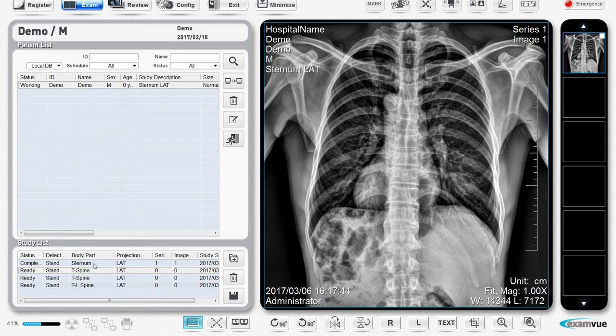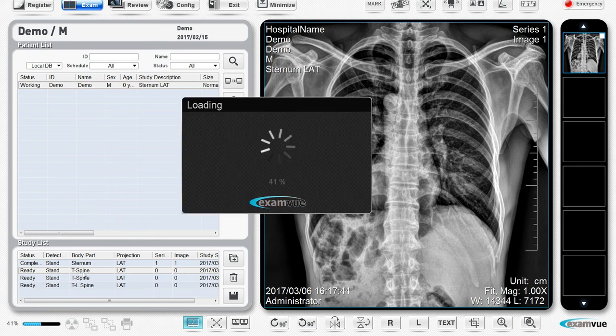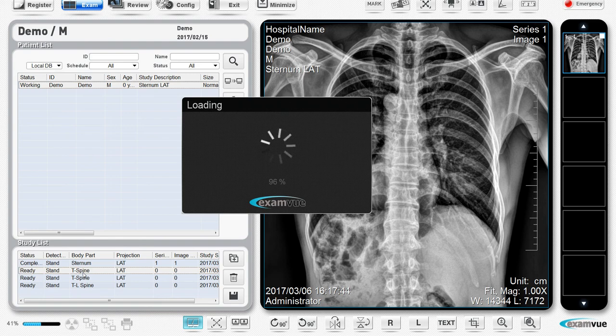If you want to retake an x-ray, simply select that shot and take a second exposure. It will add another shot to your exam. The old one won't be deleted and no x-rays can be deleted from exam view during an exam, only rejected.